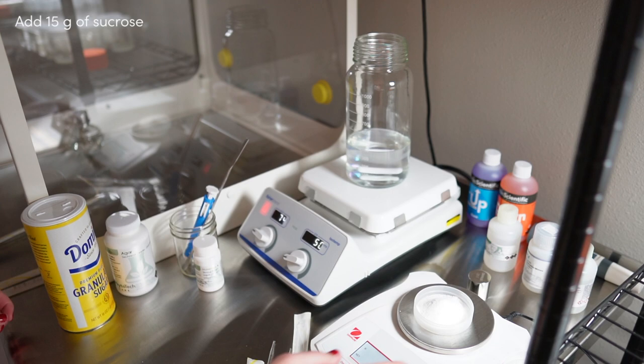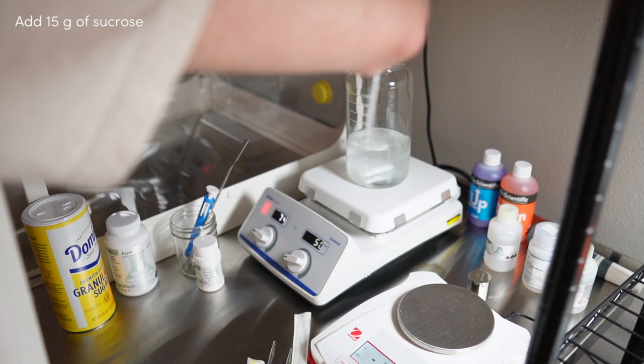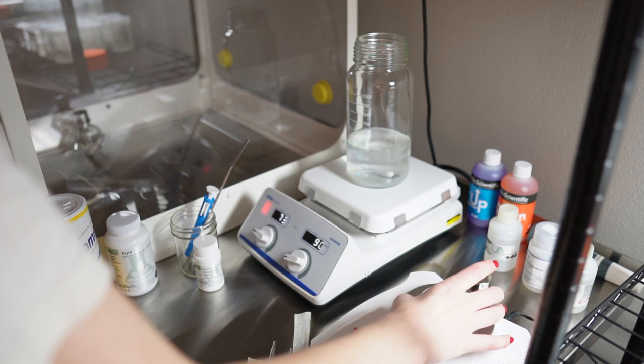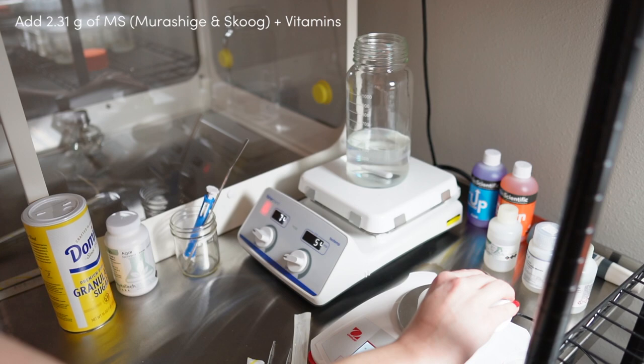I also add 15 grams of sucrose. Again, if you're making a full liter, just double it. I also recommend getting a hot plate or magnetic stirrer like the one that I have in this video. It's really hard to get these ingredients to combine properly without a heat element to it.